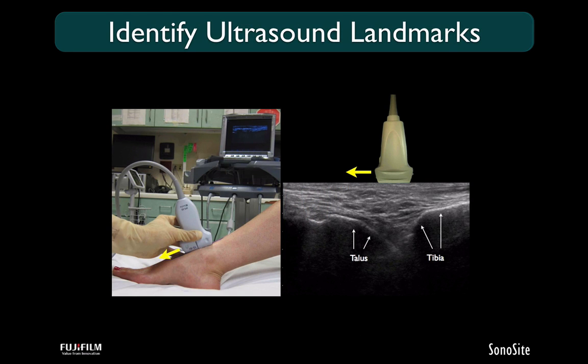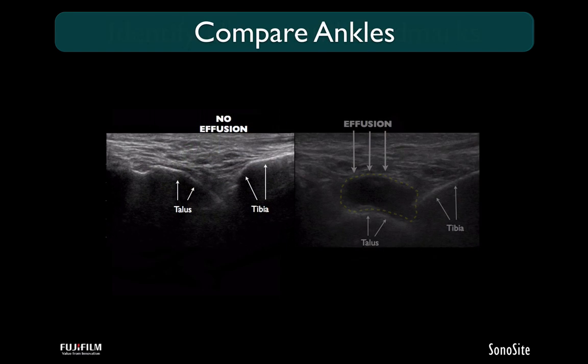So how do you do this? Again, ultrasound, the linear probe, you slide down from the tibia and slide down until you bump into the talus. You get this nice V formation, which is classic. That little area inside is just fat. You can't see much, but there's no effusion. And again, you're going to come sliding down, probe marker facing caudad.